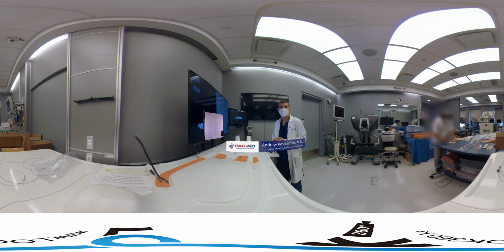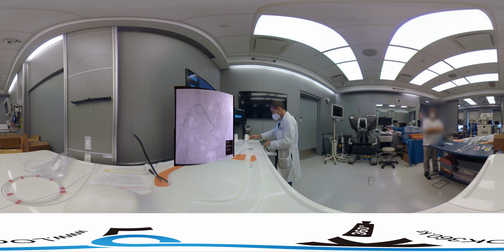So what we're going to do is go ahead and track out even more distal into this uterine artery. So we're going to get our wire out even farther, our microcatheter even farther. And I'm even going to bring our 5 French catheter a little bit farther out to give us some support. So we're going to go ahead and get out. And we're going to get to this kind of lateral branch that goes out within the uterine artery. So we're going to pull back the wire. I'm going to show you that right now. We're going to go back to AP.